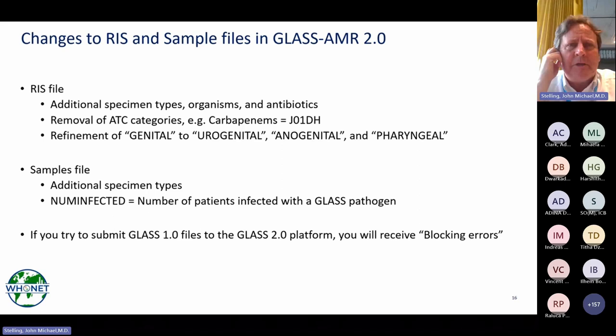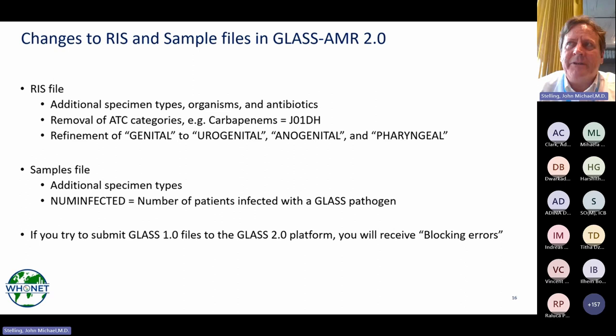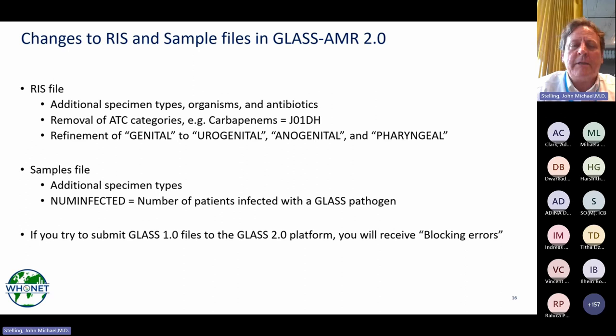We have received emails from people saying they tried to submit but received blocking errors. The reason is you need to update from the WHO Net GLASS 1.0 to GLASS 2.0 export, which incorporates the modifications. Also, GLASS 1.0 had a specimen value called 'genital,' which GLASS 2.0 no longer recognizes — it's now categorized into three new values. There is also a new variable: number of patients infected with a GLASS pathogen. WHO Net calculates all of those things automatically.